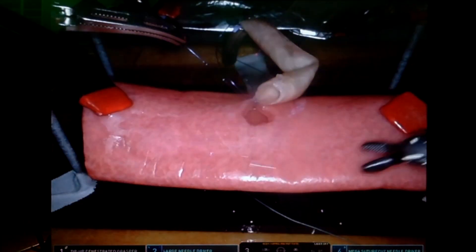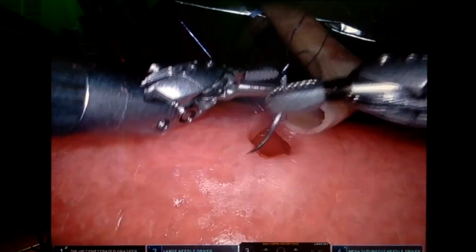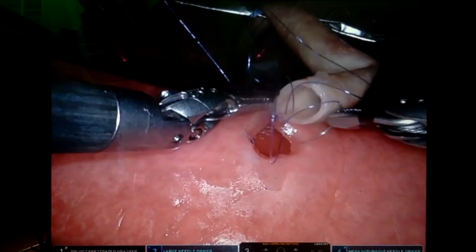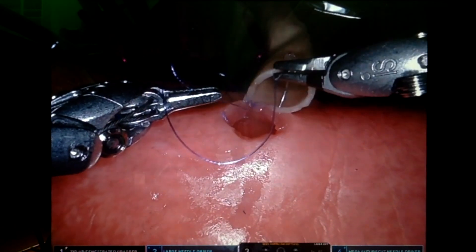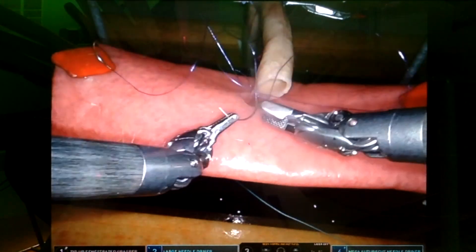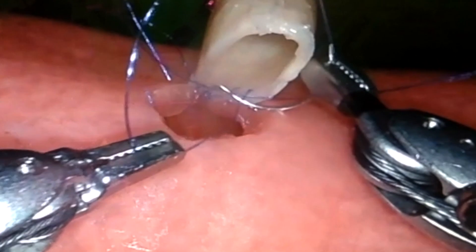Now the anchors are placed, we start with the running posterior row. During suturing, the curve of the small needle is ideal to place the suture at the correct position.